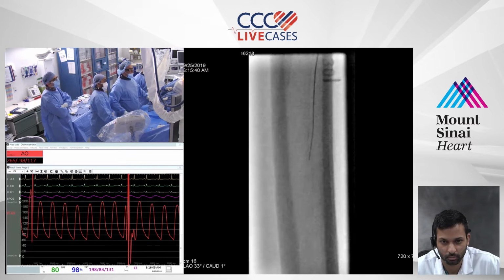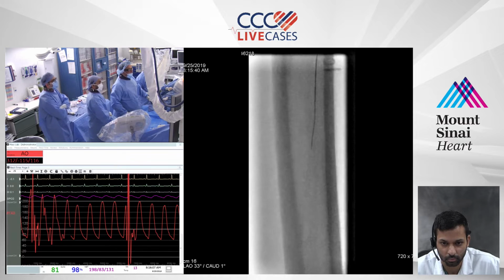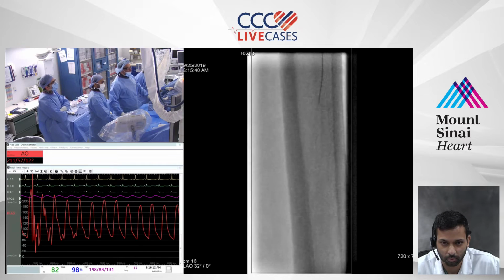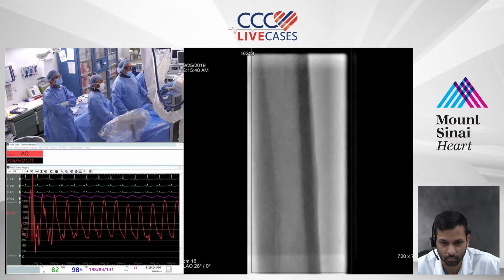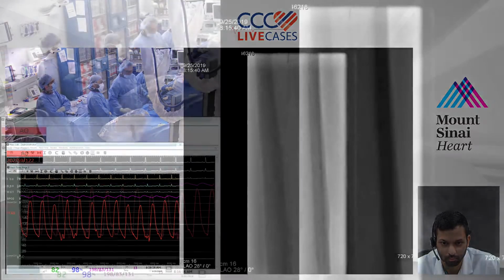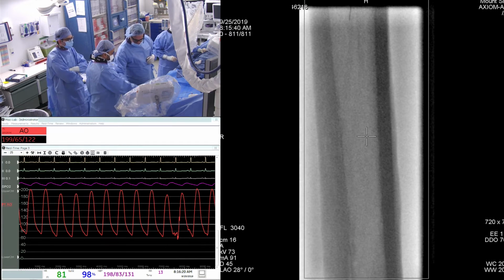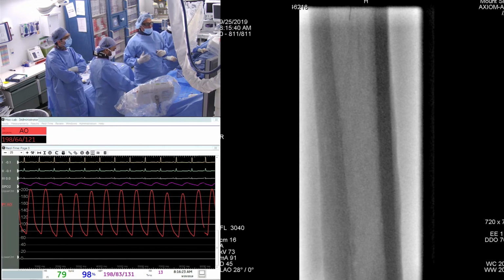Right. I agree with you. Here it looks like you can see the calcium and we're sort of in the right spot, but you don't know. Notice I'm not really advancing my catheter. I always tell our audience, the beauty is you have to really figure out, and you as surgeons 100% know the anatomy of where this artery runs.